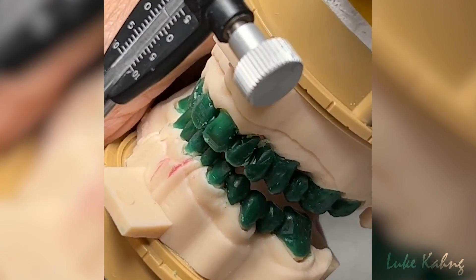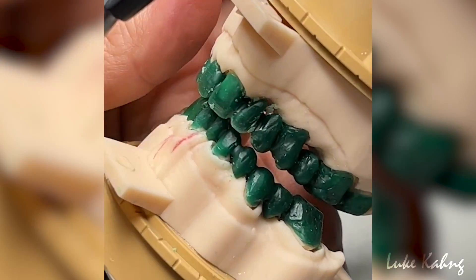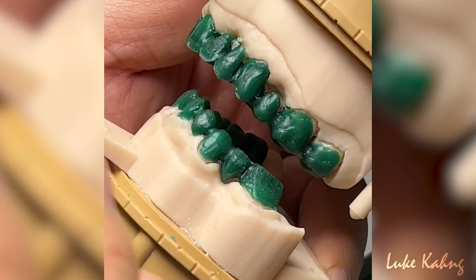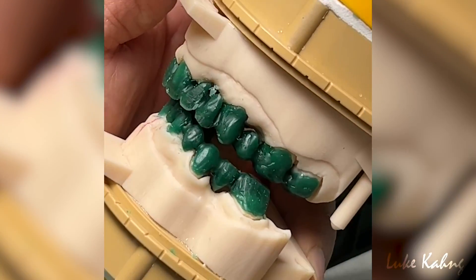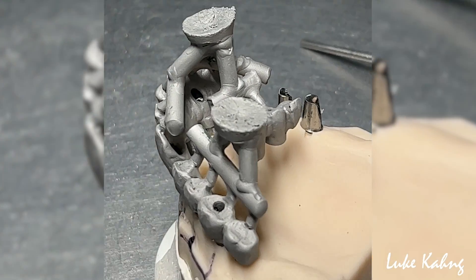Okay, now here — this is pretty good, this is okay. The only thing is the six anteriors: make them up a little high, maybe slide high here, and then bring it back.